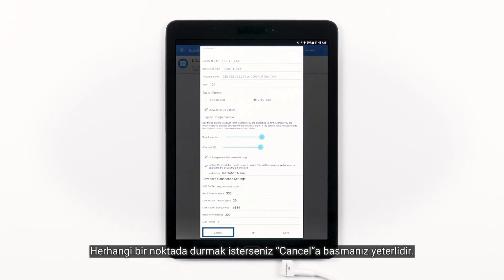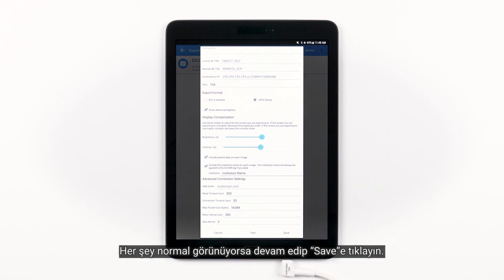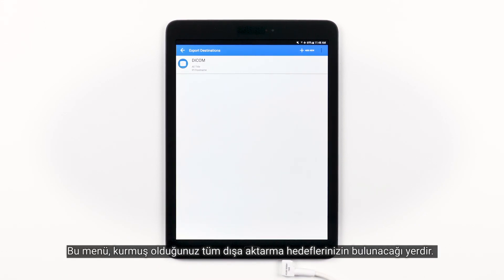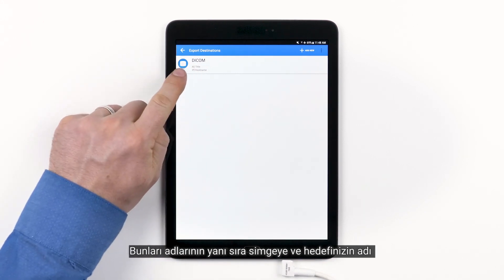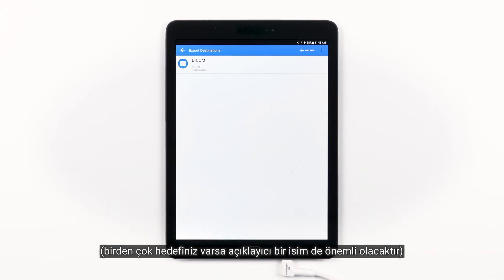You also have Advanced connection settings to further customize your export settings to fit within your IT department. If you'd like to stop at any point, just hit Cancel. Otherwise, before moving forward, you can test to ensure everything is working as it should. If everything looks good, go ahead and tap Save. You'll now see the Export Destinations menu, where all of your export destinations will be located. You'll identify them by their names, icons, and the information underneath each title, so a descriptive name will be important if you have multiple export destinations.